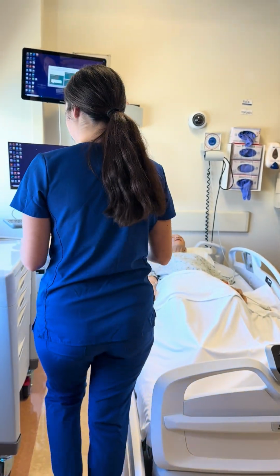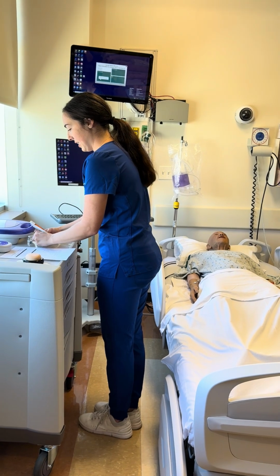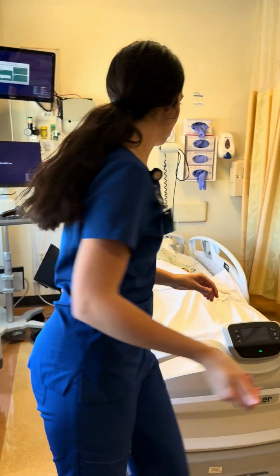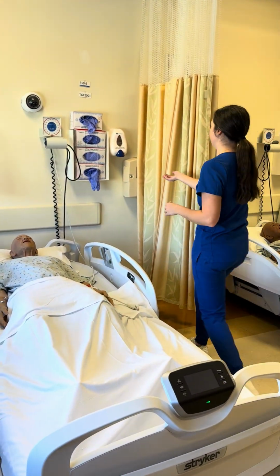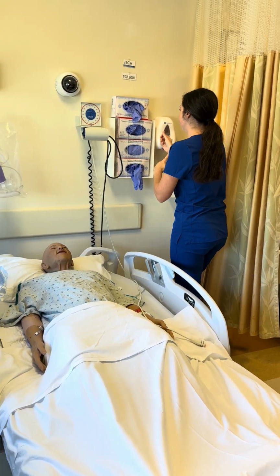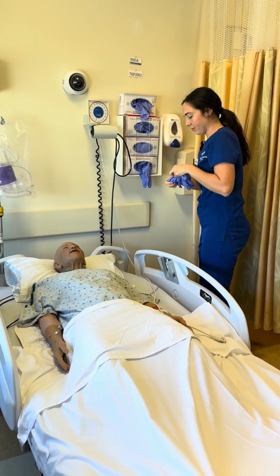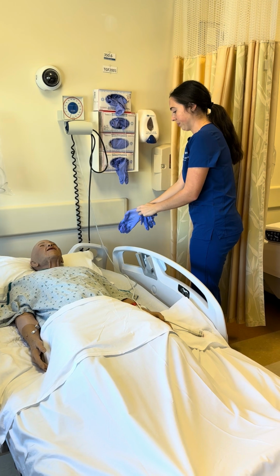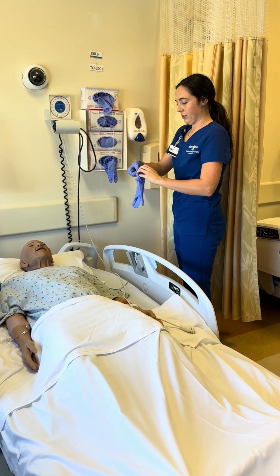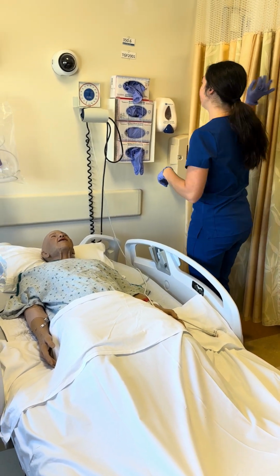Hi, my name's Lindsay. I'll be your student nurse for today. I'm going to set all my supplies down here first. Okay, I'm going to perform hand hygiene. All right, go ahead and grab my gloves. So the next thing I'm going to do is provide privacy for the patient.